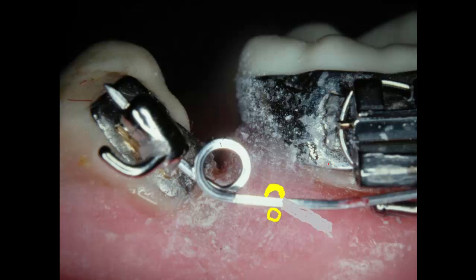This is a little closer shot showing this part of the spring that goes up into the tube that you've stuck on the side of the tooth. Now this tube doesn't have to be parallel with the surface of the tooth. Actually, if the tooth is setting more like this, you could put the tube something like this if you can't get to any other part of the tooth.